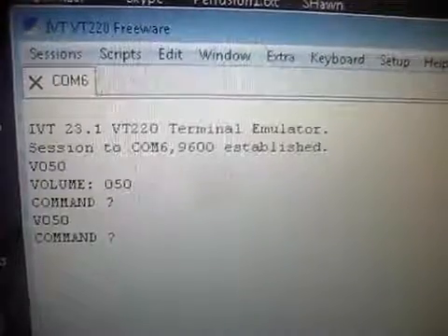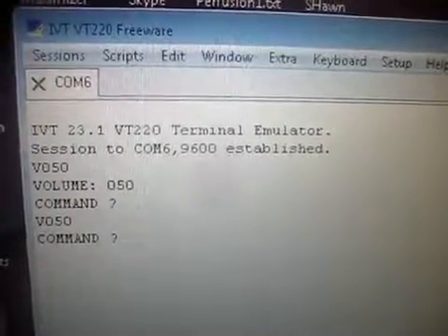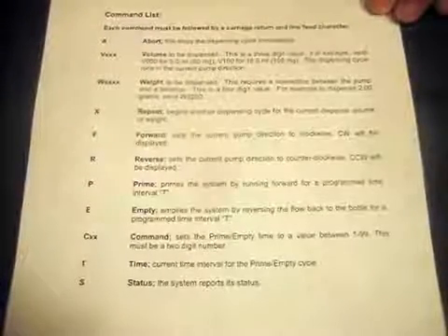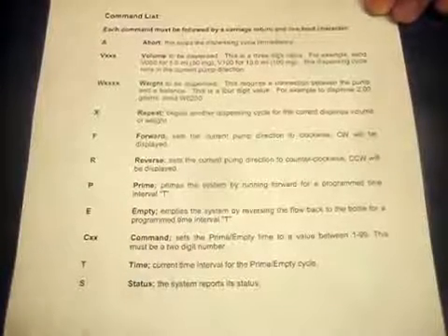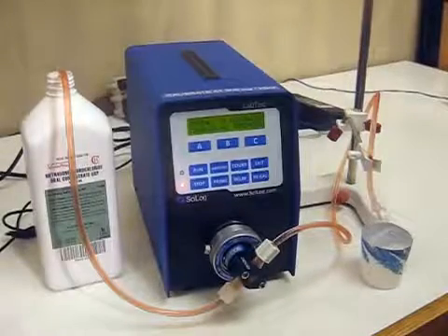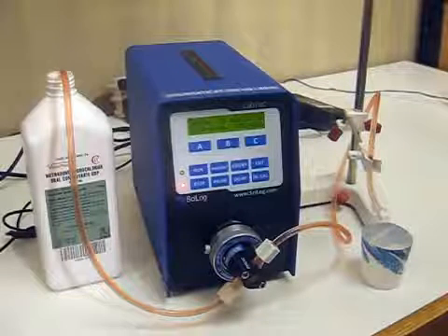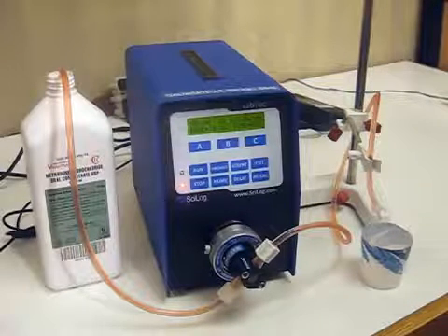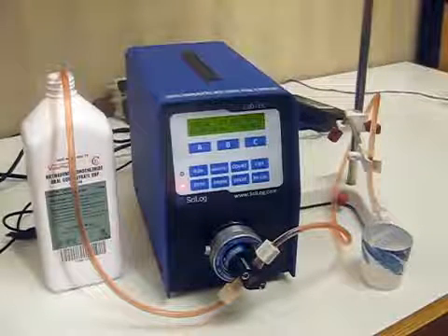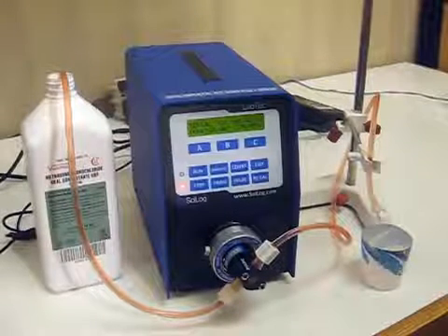The LabTec is compatible with all patient software programs. The LabTec accepts these 11 different commands, and these are universal codes for all patient software programs. And you can go to page 28 of your manual. We have now primed the system by way of the prime button in your patient software. We are now ready to dispense a given patient amount.